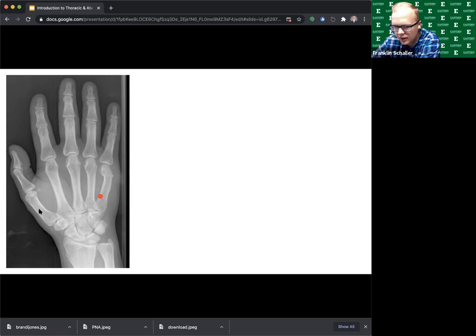That's a boxer's fracture. So the fifth metacarpal right here is an abnormality. This is a fracture. And it's not surprising given this young professor just got all mad and punched something and had that tenderness at the fourth and fifth metacarpal. Nice pickup.